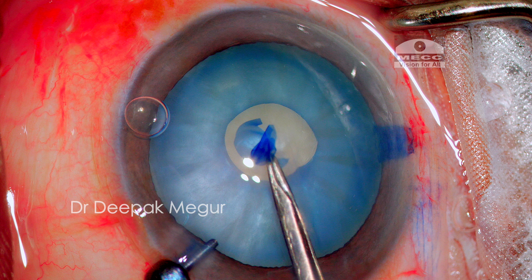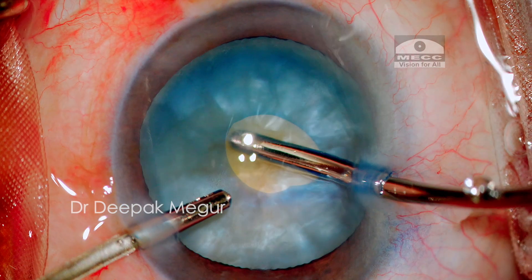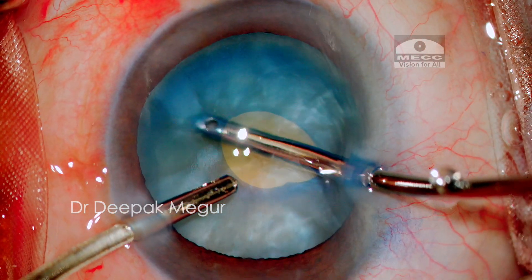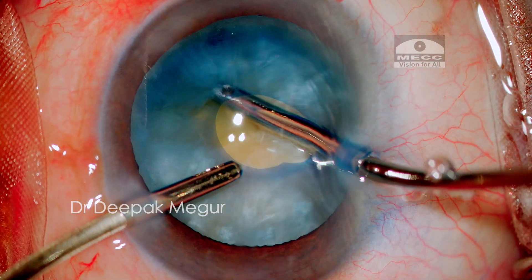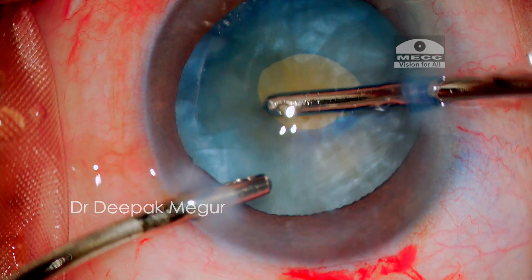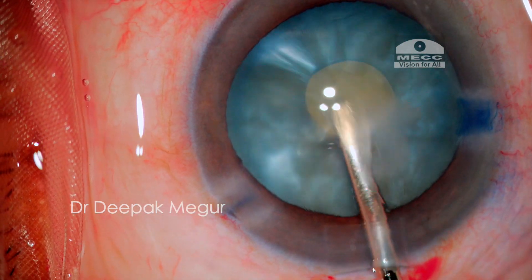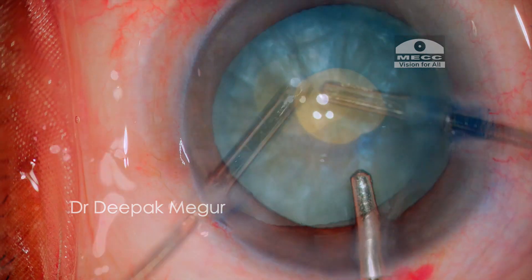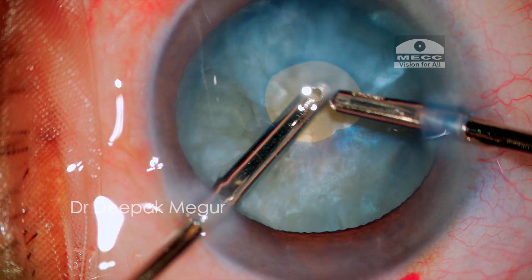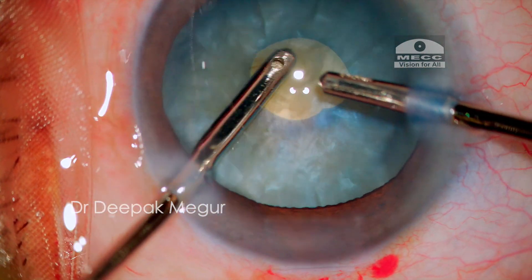Now we need to decompress the bag. The rhexis can get torn even during decompression, so I need to be careful. As I aspirate the cortex, I ensure I don't put any stress on the flimsy rhexis margin — I have had instances where it has torn away even during this step. Once a quadrant of the bag is empty, I use a direct irrigation method to wash out some cortex, taking care to press the floor of the incision to prevent pressure buildup in the anterior chamber and capsular bag. The remaining cortex from the other side is then aspirated out, clearing cortex both in front and behind the lens.